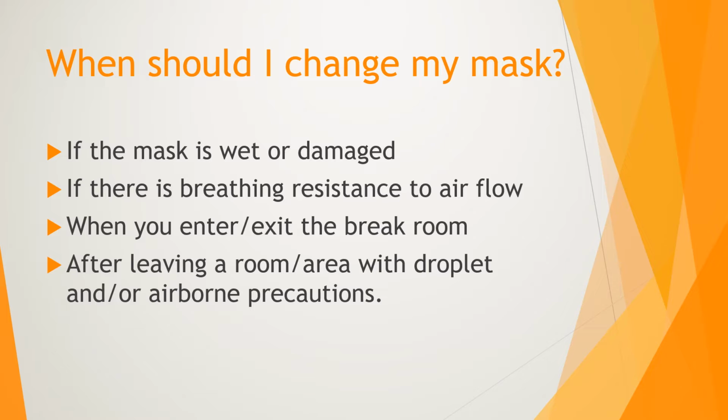So when should you change your mask? Actually, the longer you wear your mask under certain conditions, the better it works because less and less particles are able to get through to you. So you do need to change your mask if it becomes wet or damaged. If there's breathing resistance, so you've worn your mask for a few hours and then you start to notice it's a bit harder to pull the air through and breathe through the mask. This usually means that the mask is full. So all those spaces in the mask are now full of those little particles.